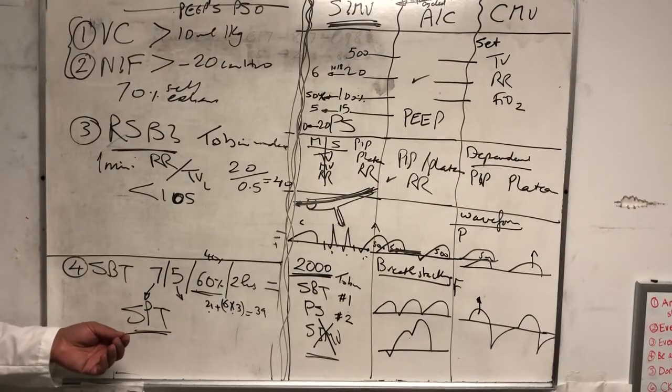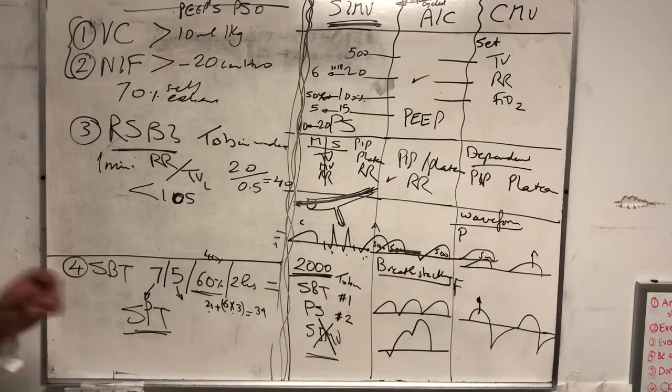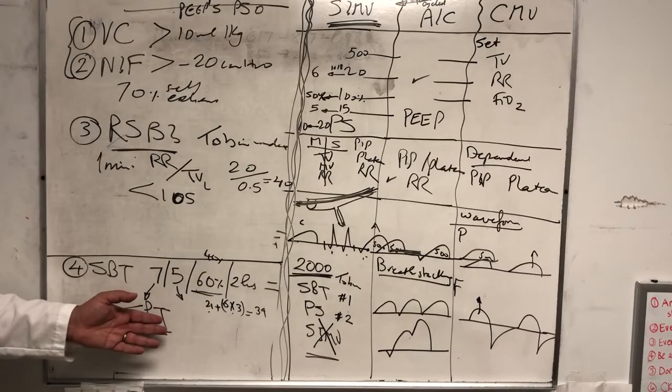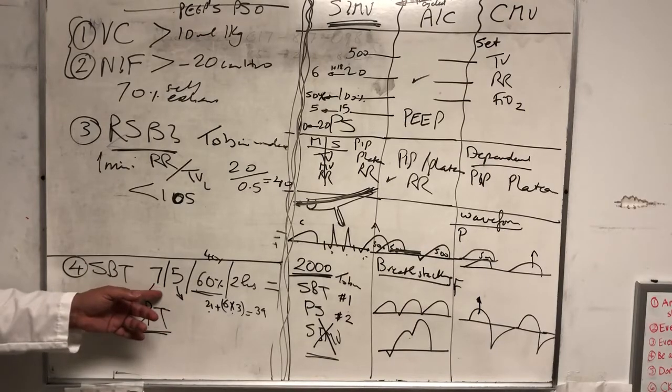And if you tell the nurses and respiratory therapists here, they'll know what you're talking about, right? And if they tell you otherwise, correct them. Say, this is SPT, it's not SBT. SPT is any pressure support and PEEP other than 7/5.